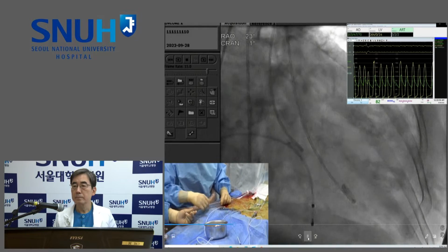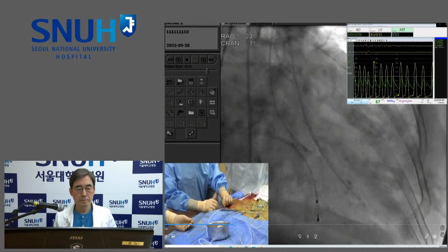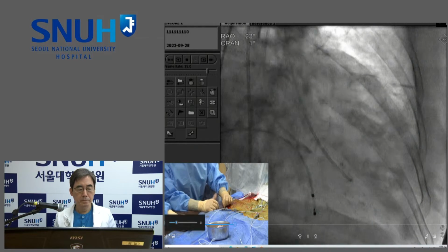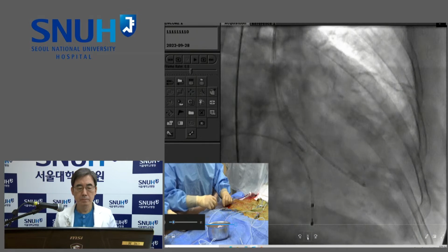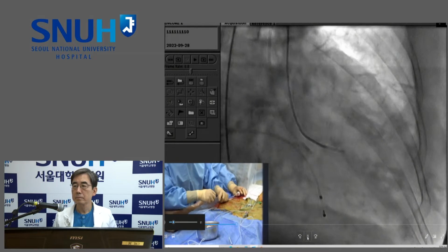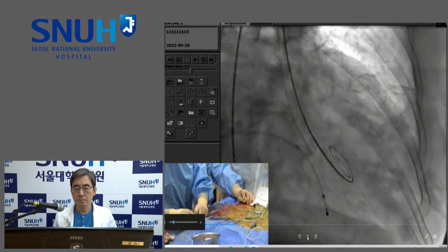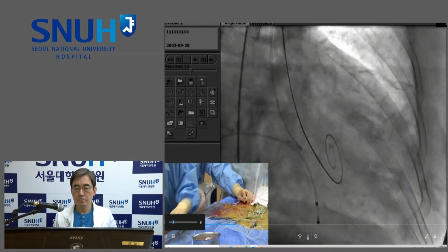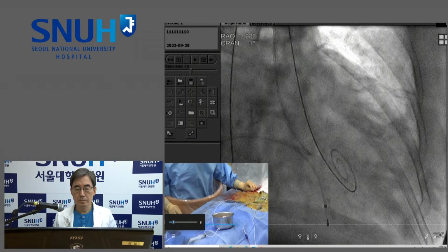And I think if you can control the depth well with the Neo 2, then that would be great. It doesn't have quite as much radial strength as the other valves, and so it may not stretch as much. But I think, again, these days with cusp overlap techniques, we would be very comfortable doing this also with an Evolut or a Sapien 3. So I think this one is kind of dealer's choice to me. I'm not sure if there's one that is particularly best.